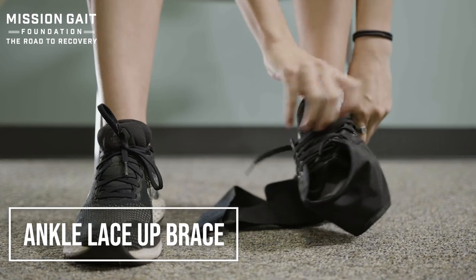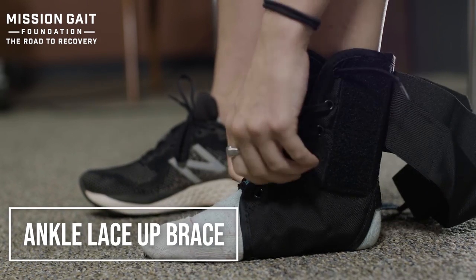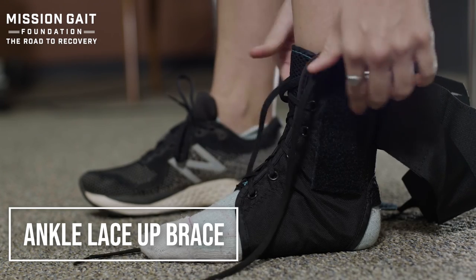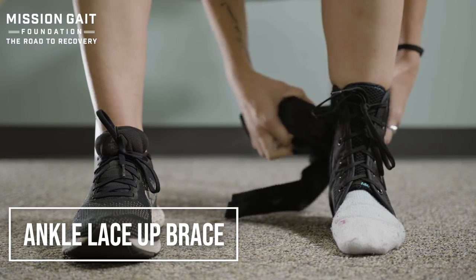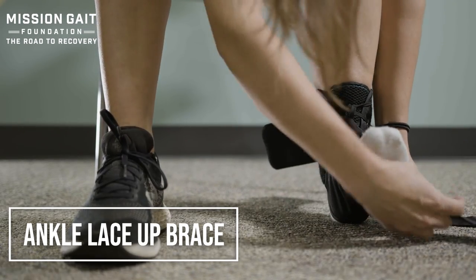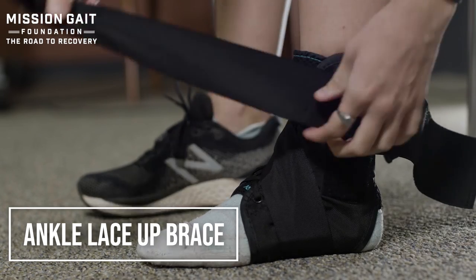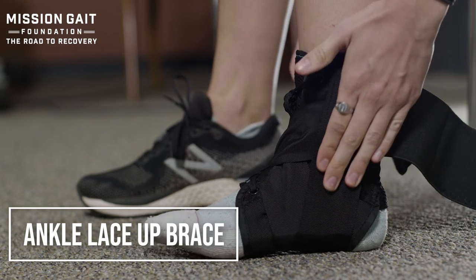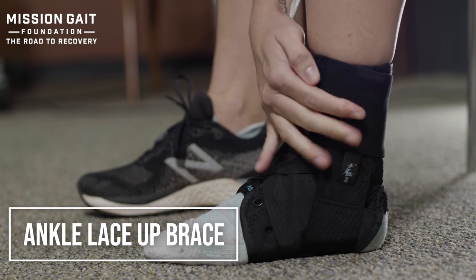This is a lace-up brace used to really stabilize or truly brace the ankle. You're going to keep the laces loose and step all the way through, then snug up the laces. Notice she won't pull the bottom lace tight — just start above the bottom lace slightly snug, and you can get tighter as you come up. You don't want to be too tight right around the foot; that'll be too uncomfortable. Taking up all the slack and tying off creates a completely stable position of the ankle in neutral. Many of them have straps to create even more tension — she wraps around the front of the brace, underneath her foot, and pulls the medial strap up.